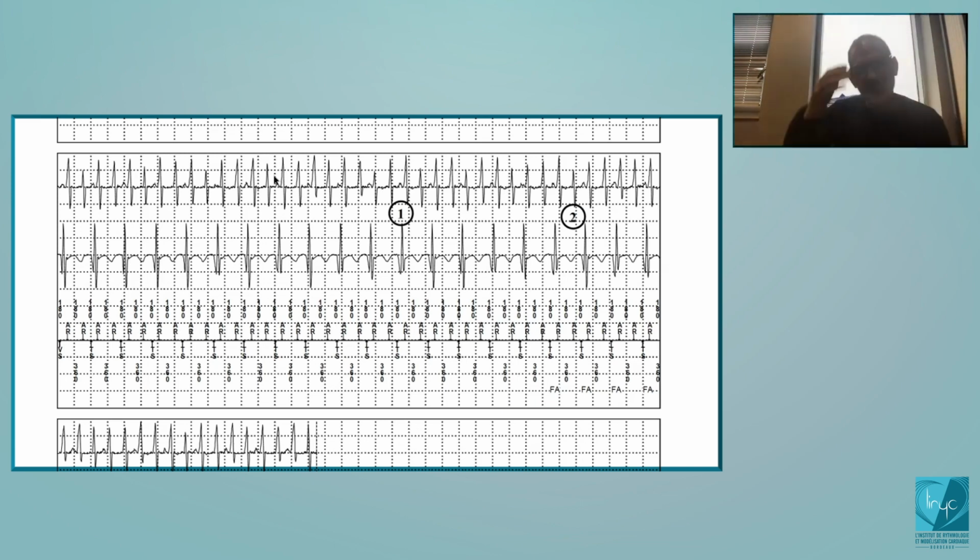Then there is an analysis of the stability at the level of the ventricle. And then the criterion for the stability is completely different here compared to the single lead discrimination. What he will analyze is 18 cycles, and he will analyze the intervals.